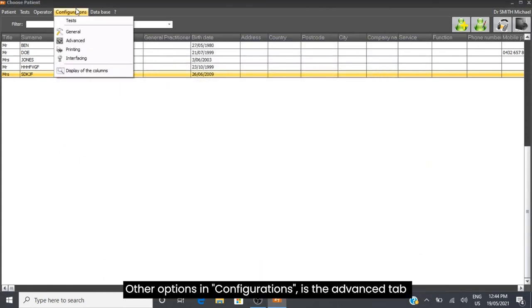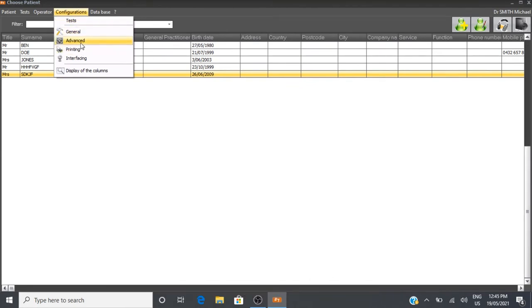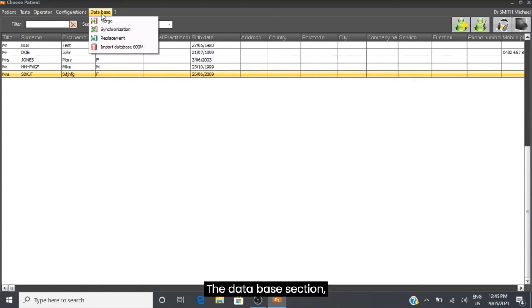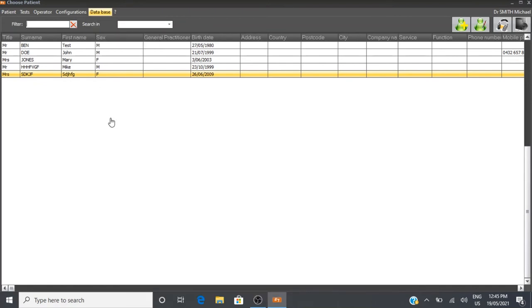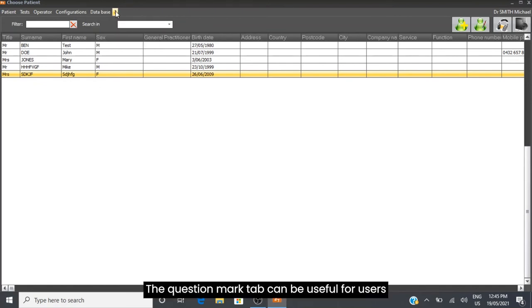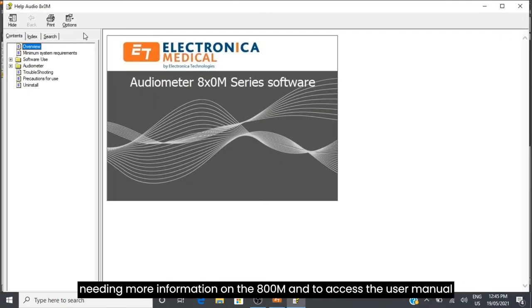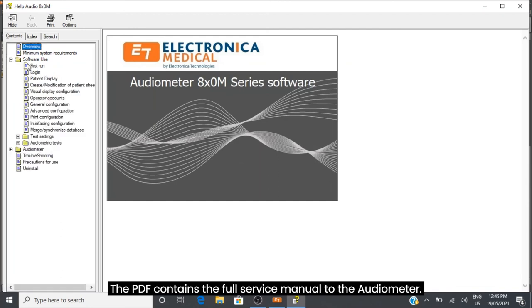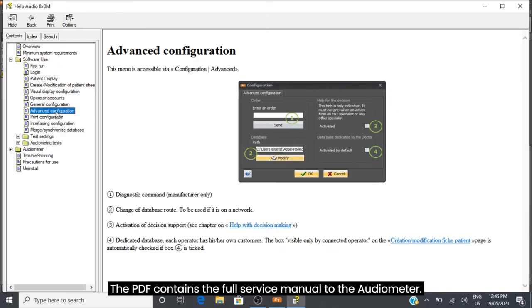Other Options and Configurations is the Advanced tab, which is for more complex audiometers. Printing is for where you want to print and other options. The Database section is where you can import previous patient details. The question mark tab can be useful for users needing more information on the 800M and to access the user manual. The PDF contains the full service manual.